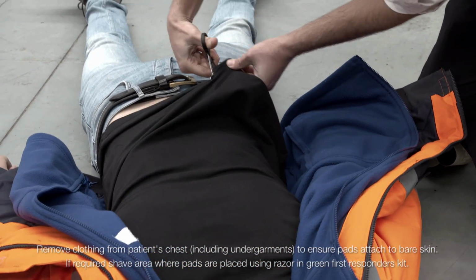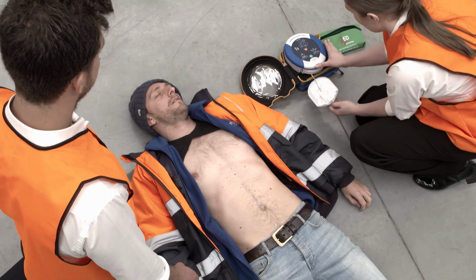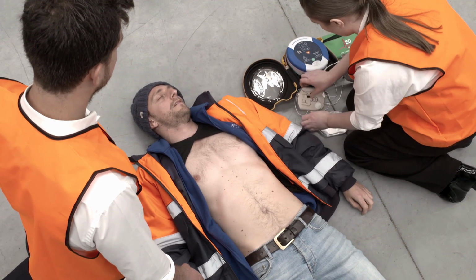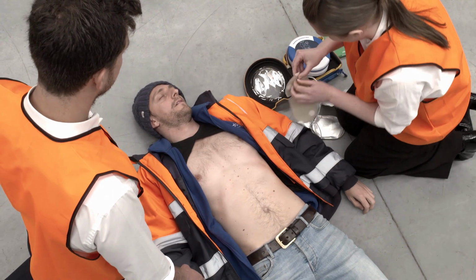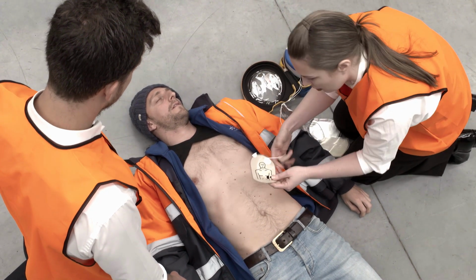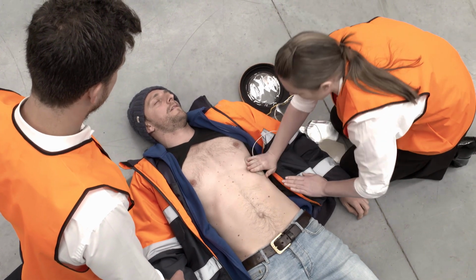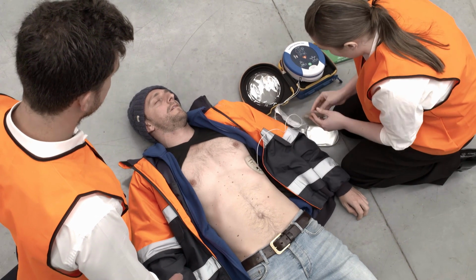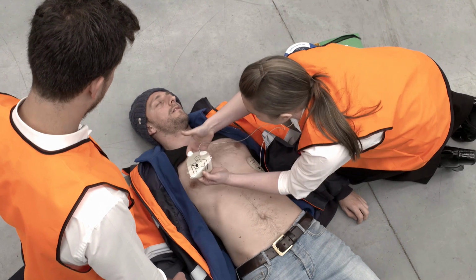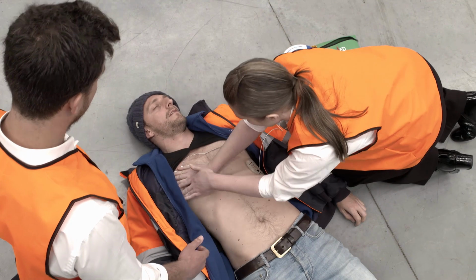Remove clothing from patient's chest to expose bare skin. Pull the green tab to remove the pads from the 500p. Peel the pads from the liner and apply them to the patient's chest as shown in the pictures. The 500p will start to analyse the heart rhythm of the patient and instruct if a shock is advised. If required, the semi-automatic 500p will prompt the rescuer to deliver the shock by pushing the orange button.